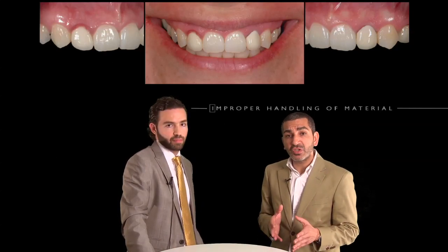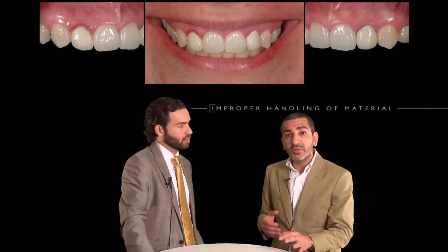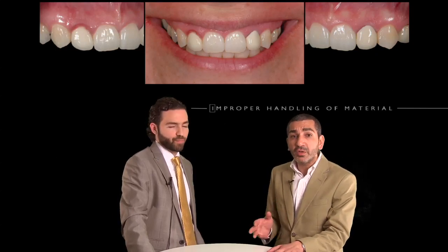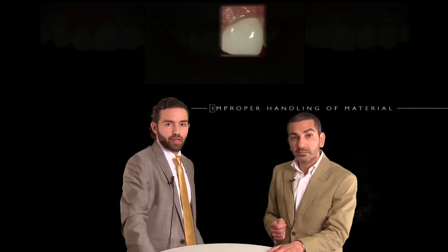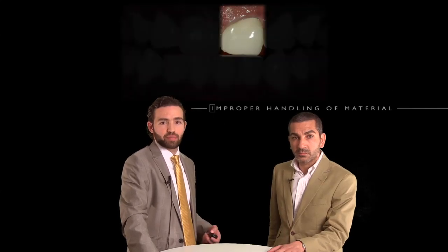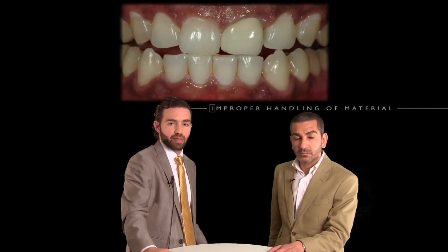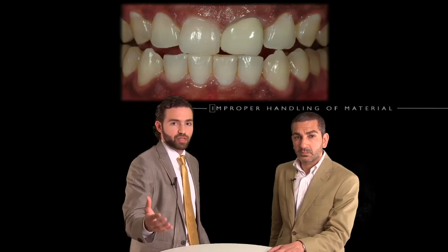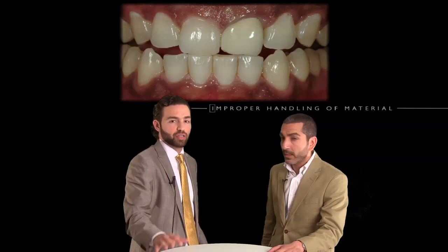So good communication between the dentist and the technician is essential, as is proper planning, to be able to achieve ideal results with porcelain fused to metal crowns. So really, it's not the material, it is the operator's skills that can be at fault here. And we also showed you this case earlier when we first started our presentation, where there was improper handling of the porcelain fused to metal, and the restoration was replaced by a full ceramic. Again, PFM is not to be blamed here. It's the skills of the operator and the technician that are to be blamed.